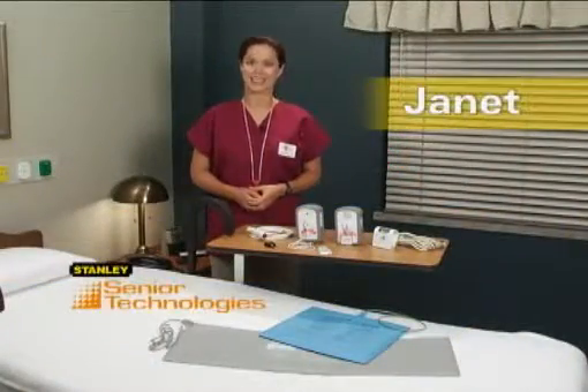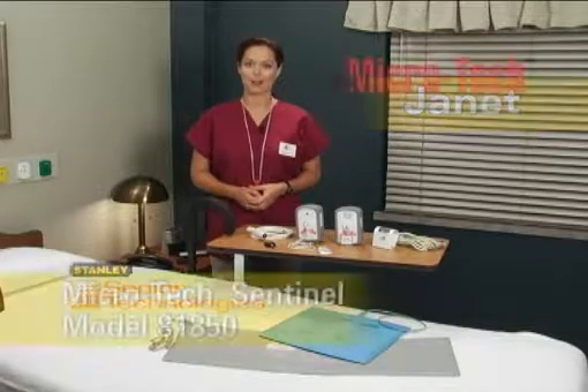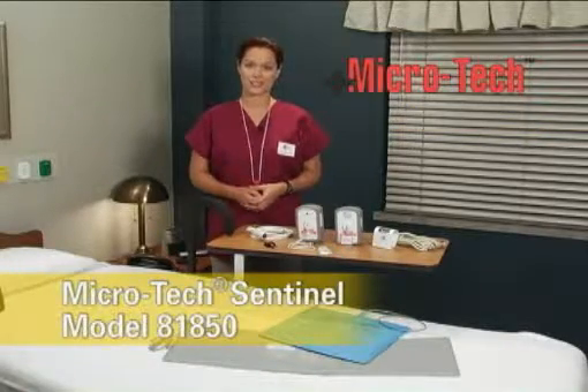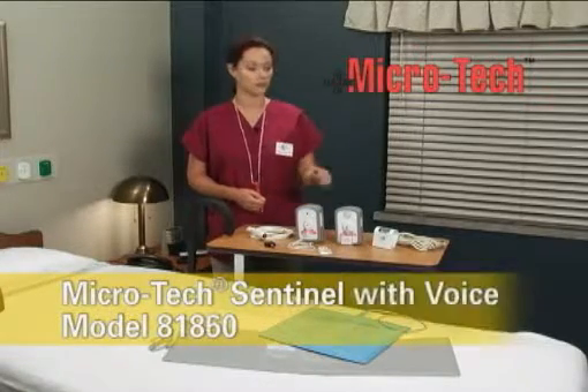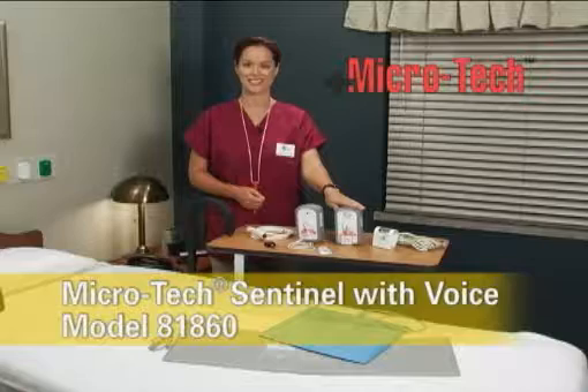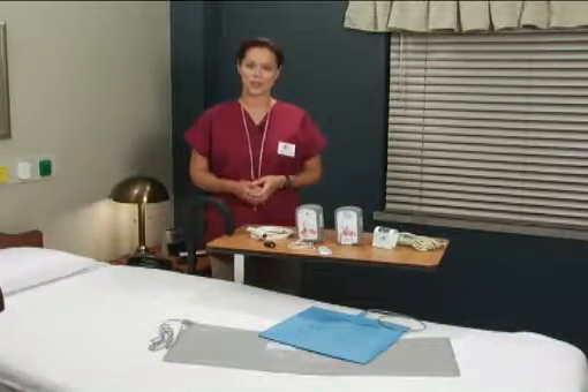Hi, I'm Janet with Stanley Senior Technologies. Today we are going to be training on two Microtech fall monitors: the Sentinel Model 81850 and the Sentinel with Voice Model 81860. We will be connecting them to a nurse call system and also installing them on a bed and a wheelchair.